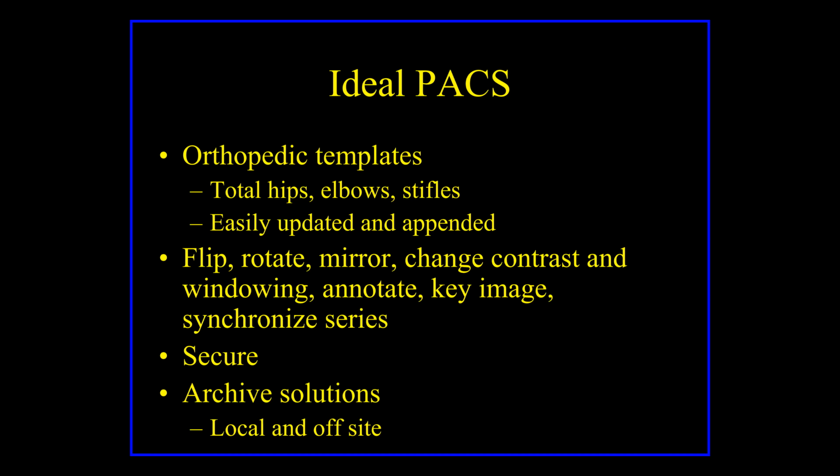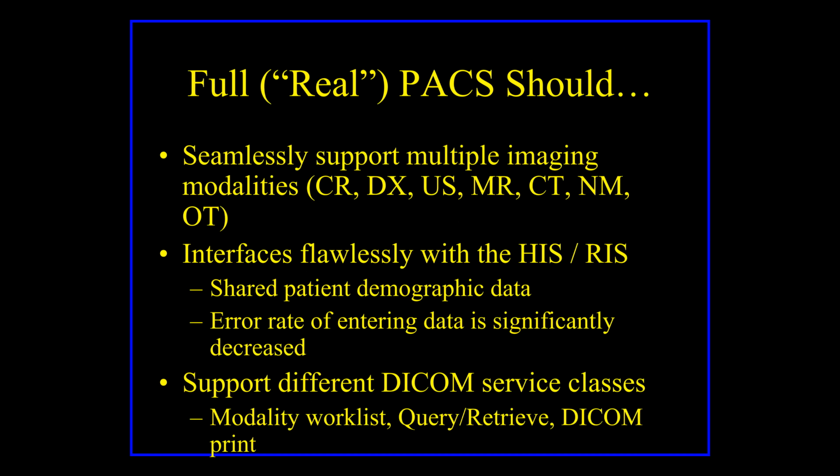The ideal PACS system will have more than just storage. It allows you to do manipulation too. So even if the image was taken 2 years ago, you can go back and adjust it, flip it, rotate it, stuff like that. You have to be careful with some of the vendors when they sell you these systems. A full PACS system will let you do image manipulation for any kind of medical modality, not just x-rays. If you have ultrasound video clips, it will play them. If you have CT and MRI, you can do what's called stack imaging. So a full PACS system will allow you to properly manipulate any kind of medical image there is.